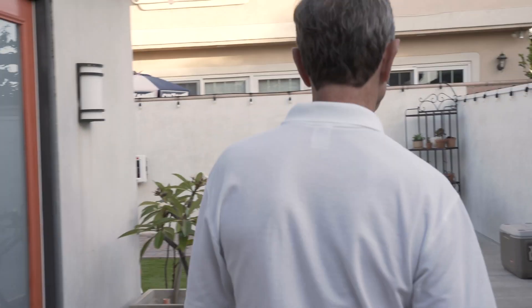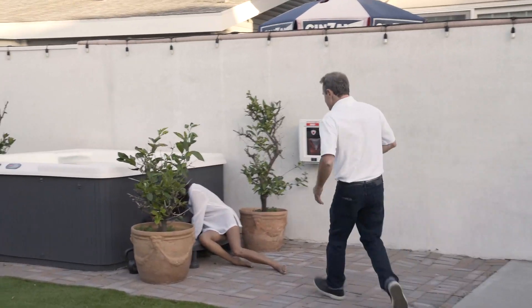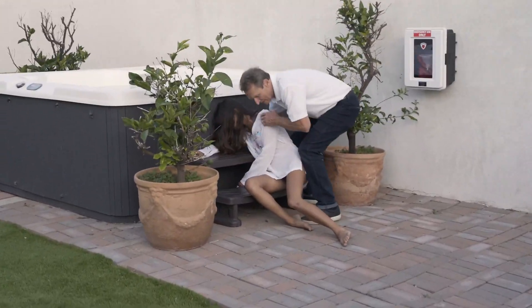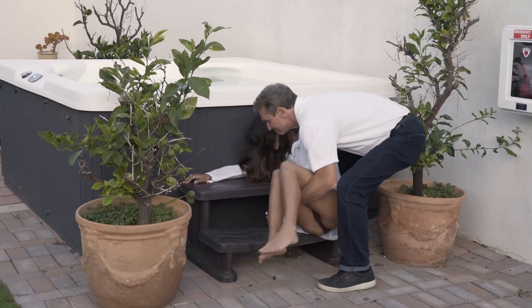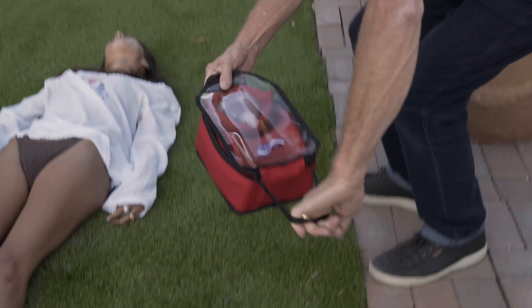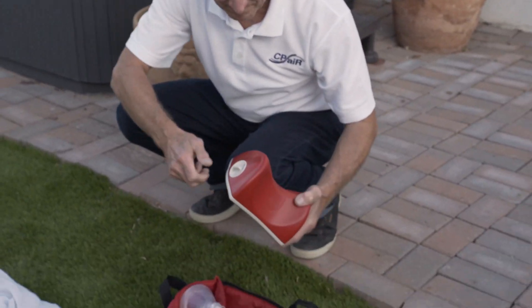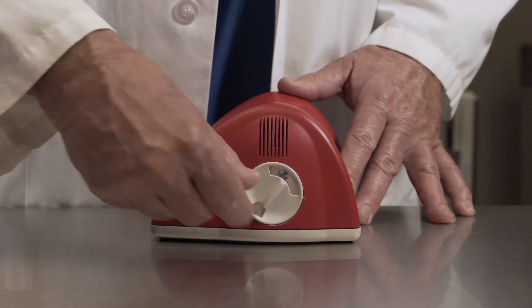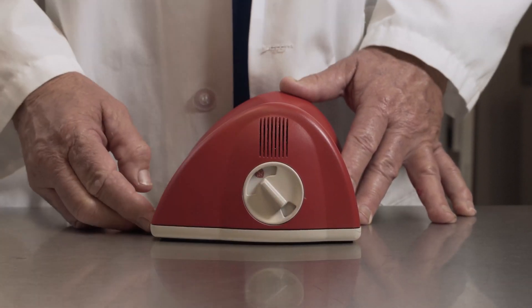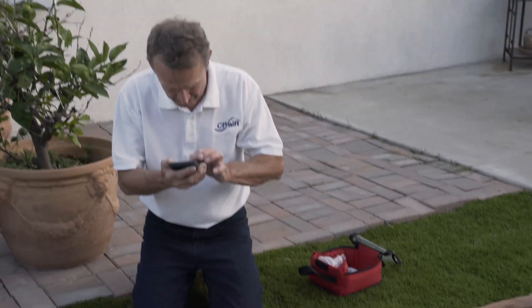Now that you have become familiar with your PAL, you're ready to practice a simulated event. Using our two volunteers, we will demonstrate performing CPR and describe each step as we go. Here's a more likely scene whereby someone in your home has a cardiac incident requiring CPR right in your own backyard. You locate the PAL, remove it from its case, and turn it on. You see there are two modes on the side of the device: one with just compressions, and one with compressions and breaths. We will demonstrate the latter. Listen and do exactly what your PAL tells you to do.